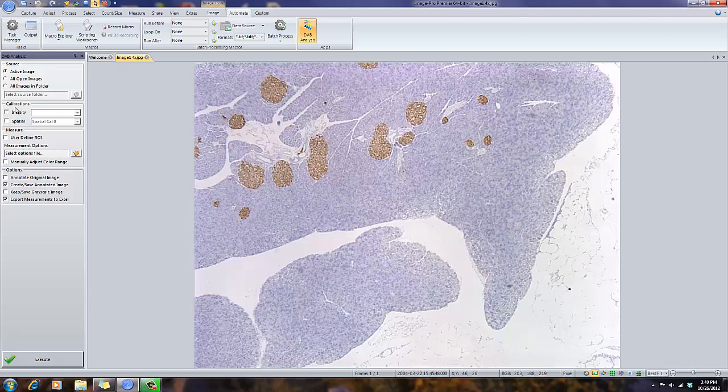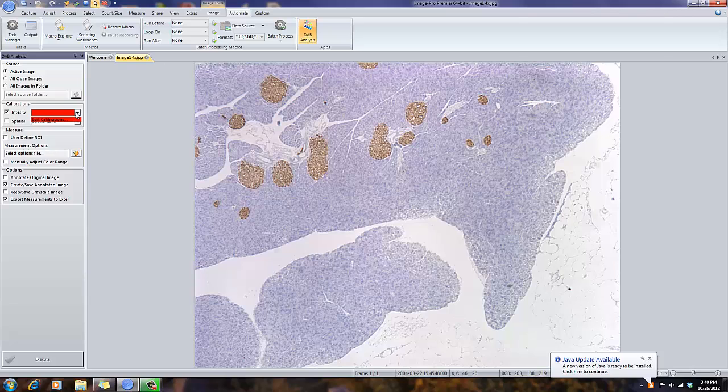If I have a density or spatial calibration available, I can select that, again, browsing to the correct folder.